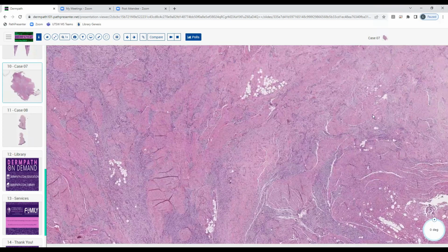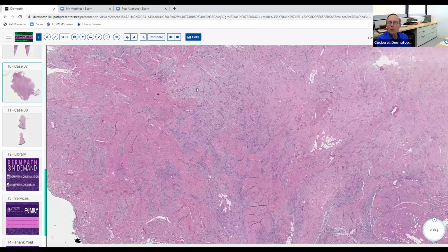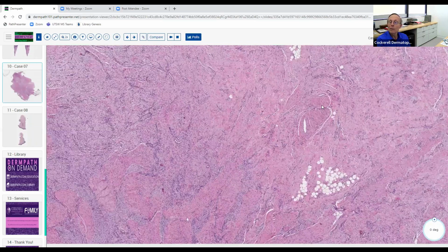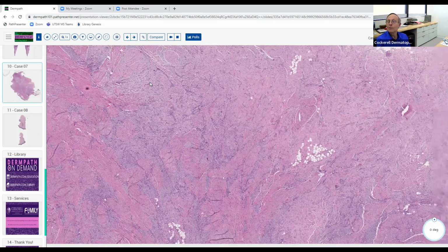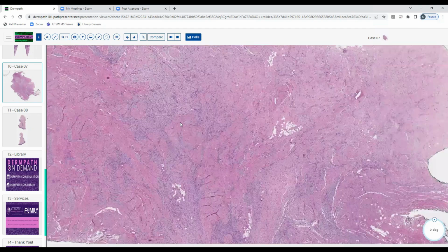Here we've got a lot of these whorls of this more primitive fibromucinous fibroblastic proliferation with whorls of thickened collagen forming these little fibrotic areas. So this is a hamartomatous condition. And if it were in infancy, a very young kid, it's a fibrous hamartoma of infancy. So that's what this is. This is an example of that.